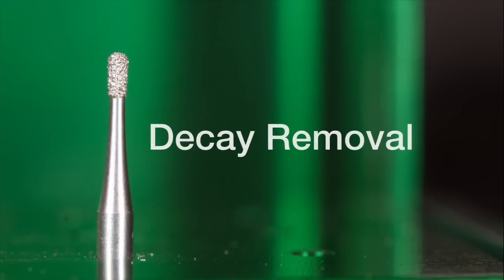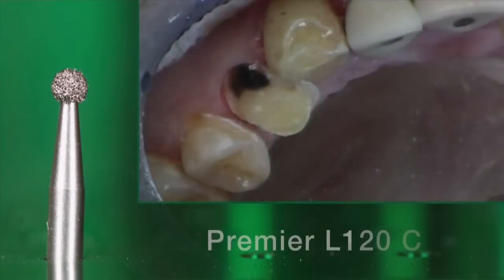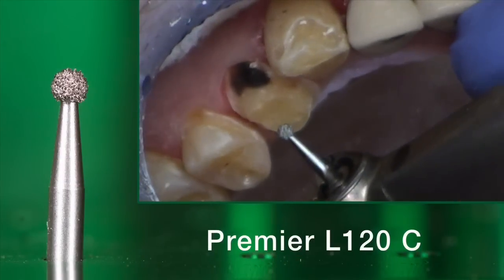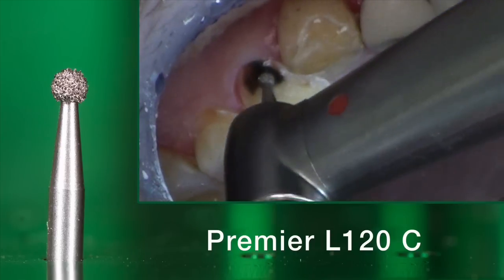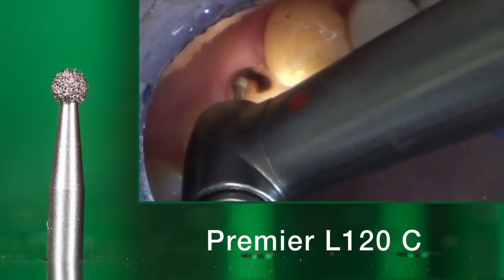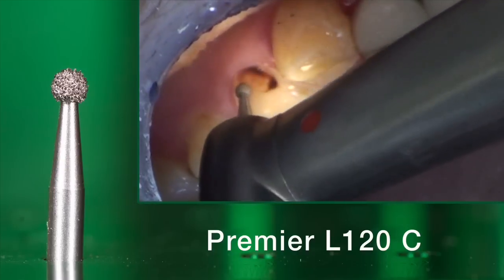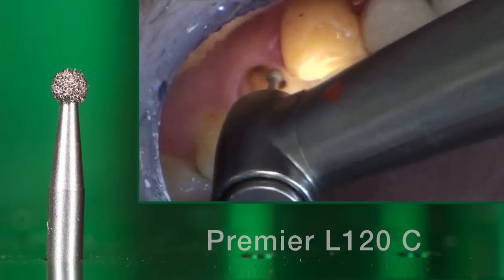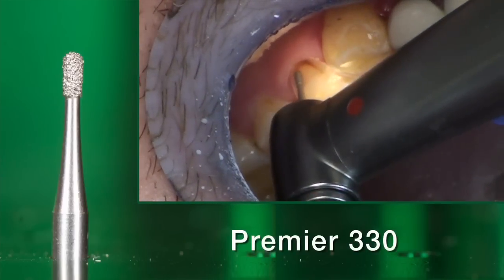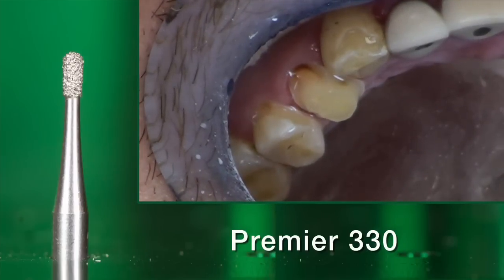Now that we've gotten the general outline for our prep, it's time to refine things a bit. We need to go back and remove some decay and then potentially fill in those areas to avoid any undercuts. I've removed the decay on the adjacent teeth, and now I'm going to remove the decay on the crown prep using a diamond tipped round end burr. This works very well for removing sclerotic or decayed dentin, as you can see it comes off very nicely. We might also use a 330 burr in order to refine that decay removal even further down in those very tight marginal areas.